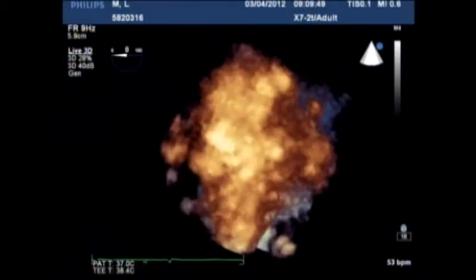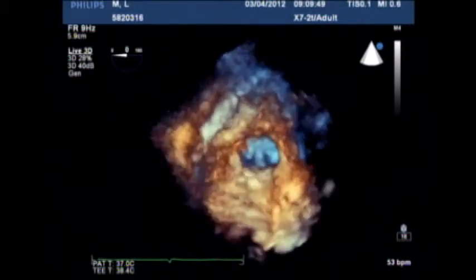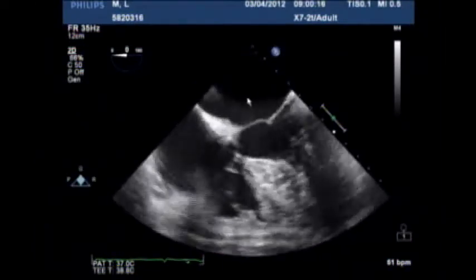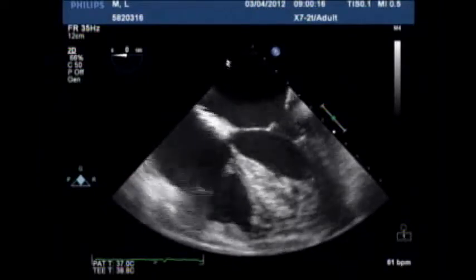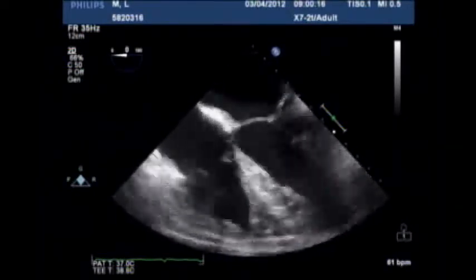And we're going to show an edit case of left atrial appendage closure with the ACP device. Okay, starting here in four-chamber view, we can see a very hypertrophic septum and dilated left atrium. Systolic function is good.